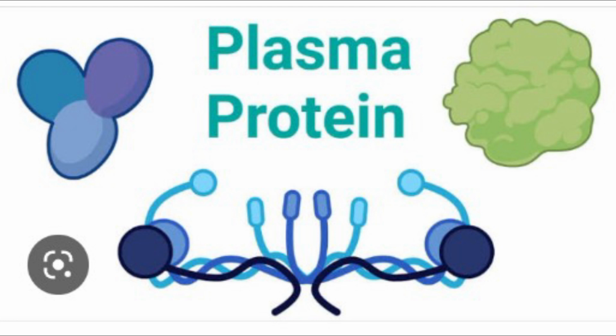Heat and acetic acid. A sample of freshly collected urine is mixed with 3% acetic acid and heated over a flame to boil. The turbidity or cloudy precipitate indicates the presence of protein, mainly albumin. Normal urine gives a negative test.